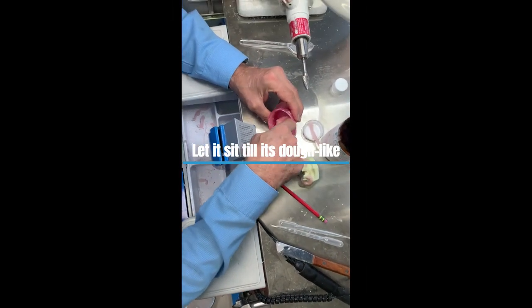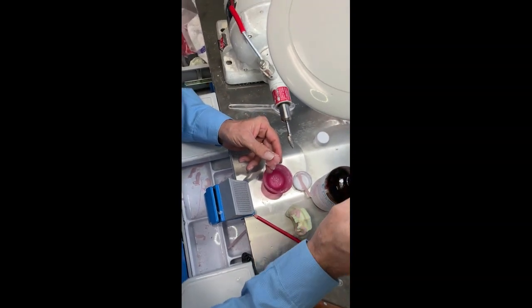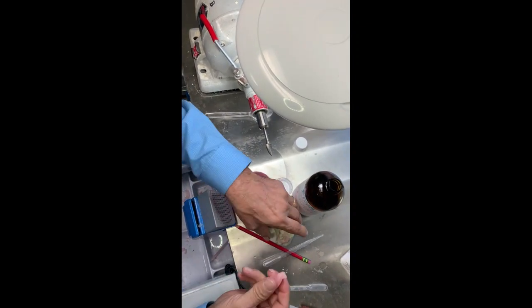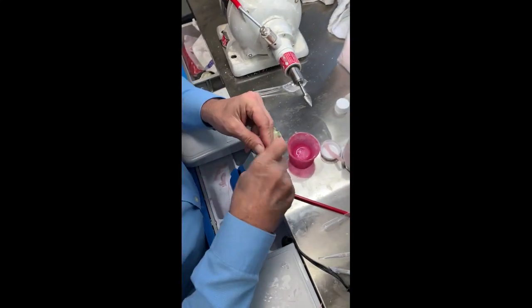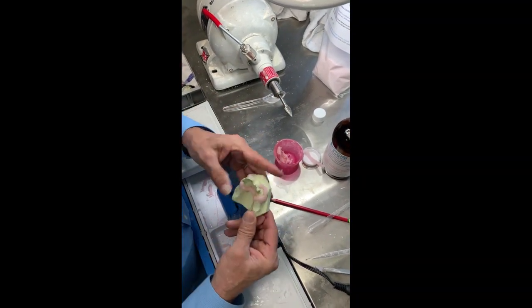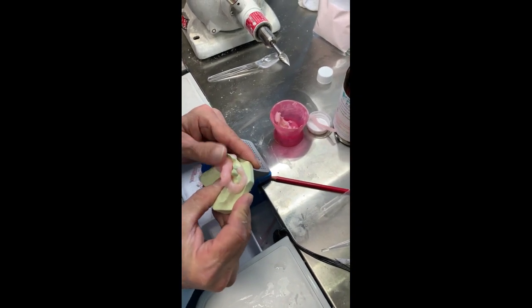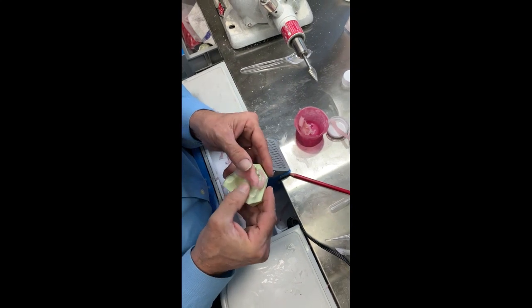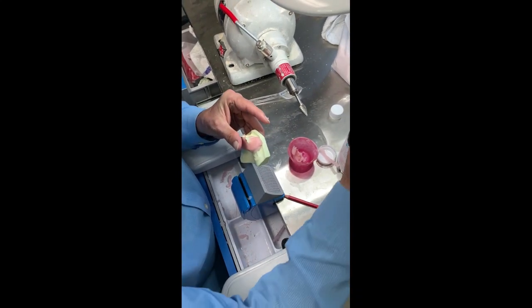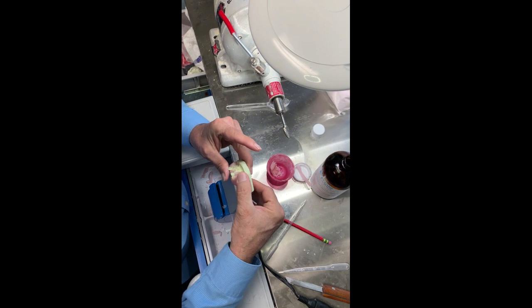Okay, so we're ready now. This is basically how it's supposed to look. You can dampen it down a little bit if you need to. Just a little bit. As you see, it's very easy to work with. What I'll do is go ahead and place it where that wax is. You kind of just smash it down right where that wax is, and it'll automatically form to that wax. You put a little bit of liquid here just to make it easier to flow.